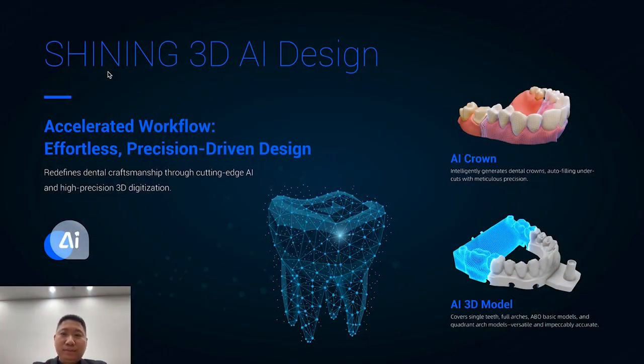Hello everyone, welcome back. As you know, Shining 3D is focused on 3D technologies, but nowadays AI technology is getting advanced and mature. Shining 3D has also invested a lot in AI technologies.